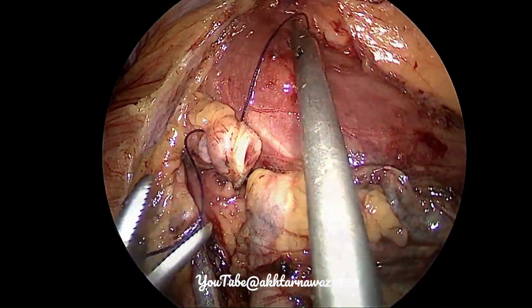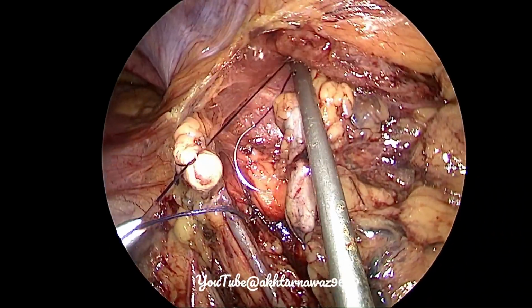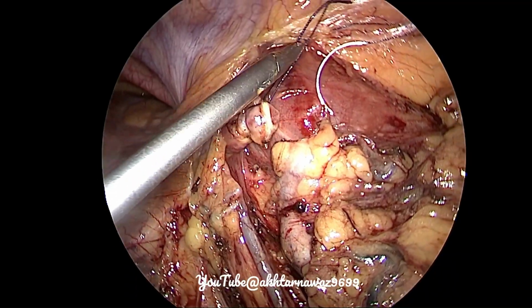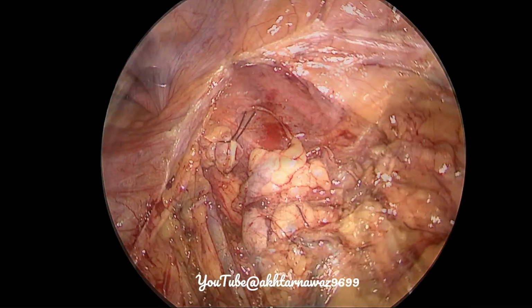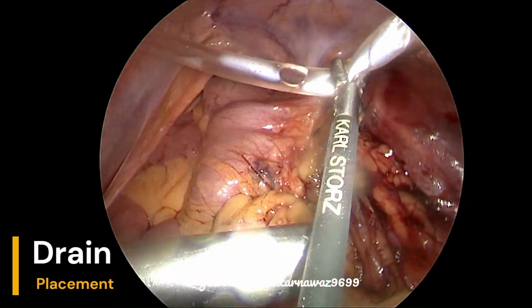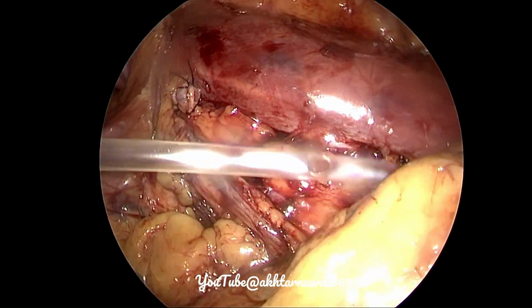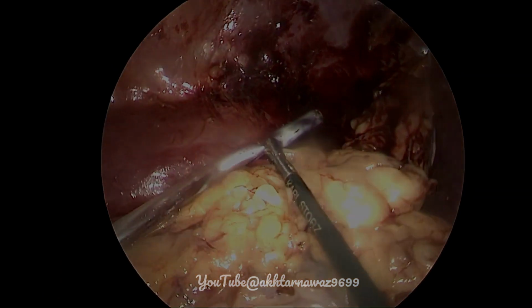So here you can see that it has nicely been transfixed using a 2-0 Vicryl, and suture is then cut, and after doing that we will place a drain which will be removed on the first or the second post-op day, and this marks the end of the procedure.